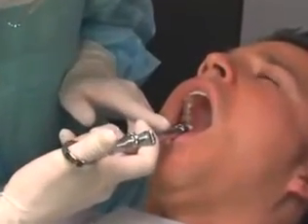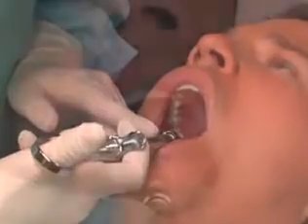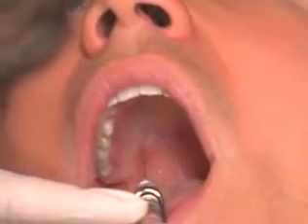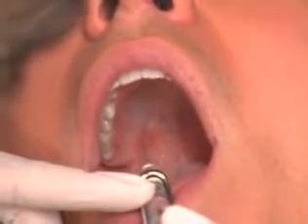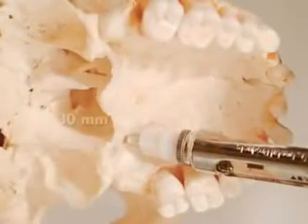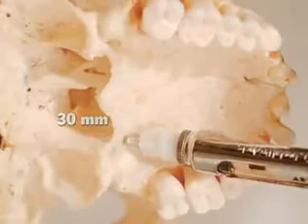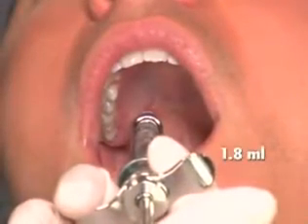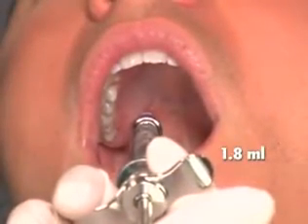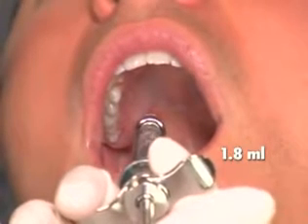The needle is inserted into the soft tissues over the greater palatine foramen, then advanced into the greater palatine foramen to a depth of 30 millimeters. Following negative aspiration, 1.8 mls of local anesthetic is deposited slowly over a minimum of one minute.